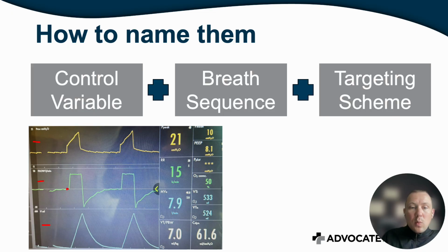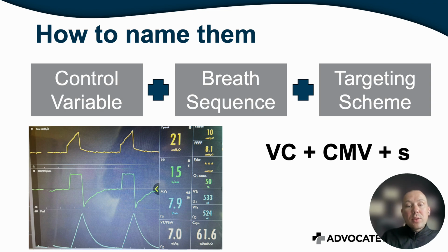Now, there is no white blip right here or right here, meaning that the ventilator likely initiated the breath, and also we can tell that the cycling was done by the machine. So this mode will be called VC because we are controlling the flow.